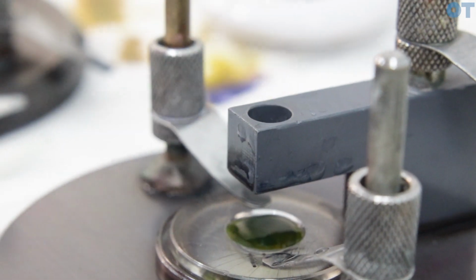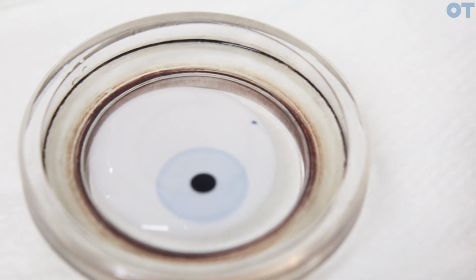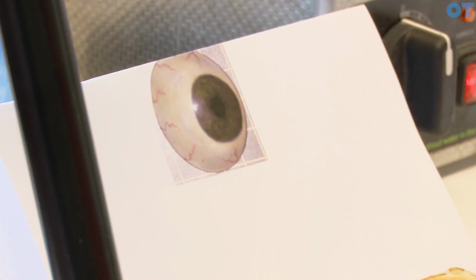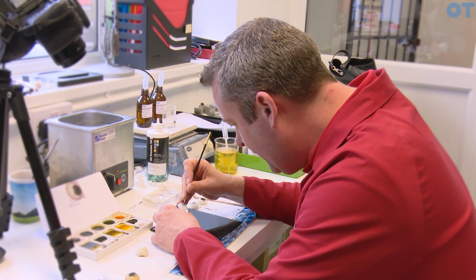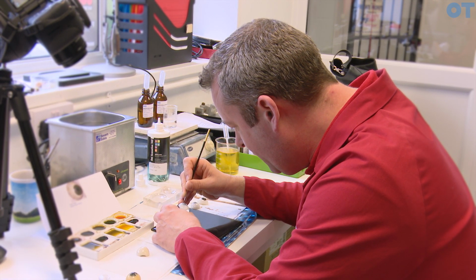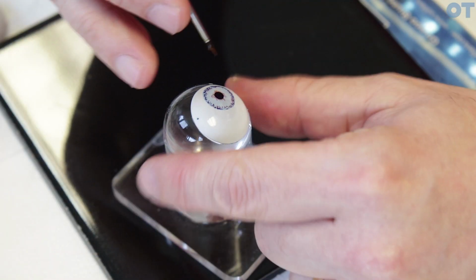And then I've tinted on the iris very lightly just to see sort of where I'm supposed to be painting now. And in this case it's a fairly dark grey with a little bit of hazel in there, a little bit of green. So it's a pretty dark colour. So that blue's not going to affect it at all. I find there's an element of blue in most things that I'm painting. There's an element of blue in there.